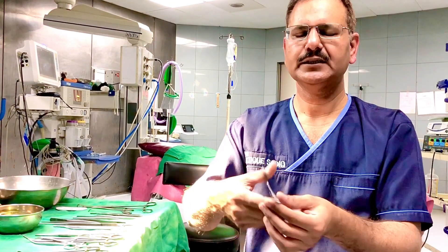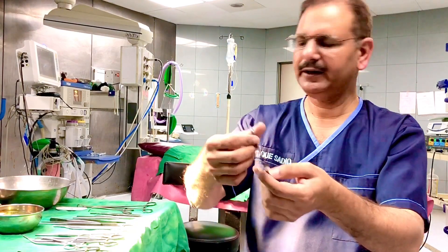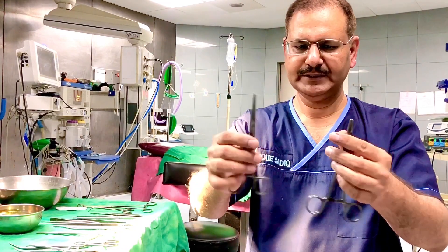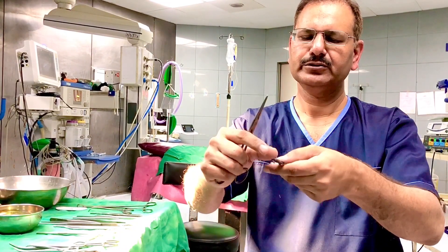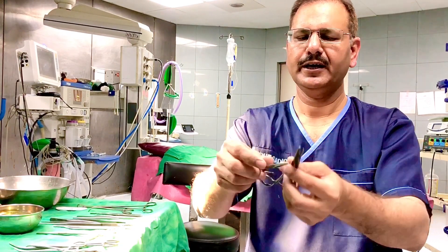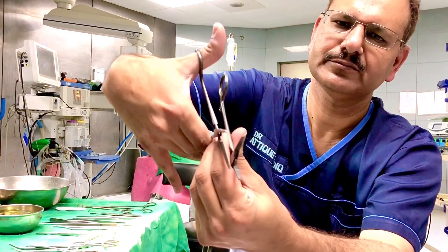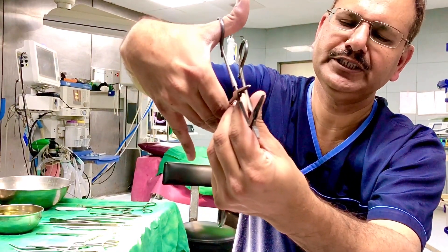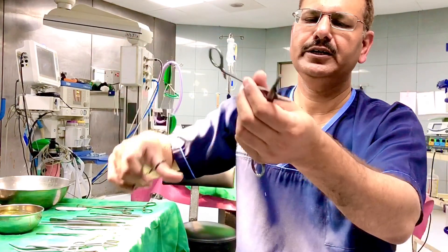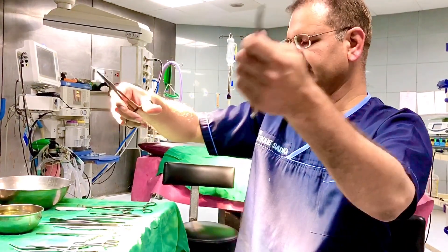This is a needle holder. The difference between a needle holder and forceps is that the jaw part of the needle holder is shorter compared to forceps, and secondly the corrugations are different — needle holders have crisscross corrugations, while forceps have straight corrugations. So a needle holder has a shorter jaw and crisscross corrugations.